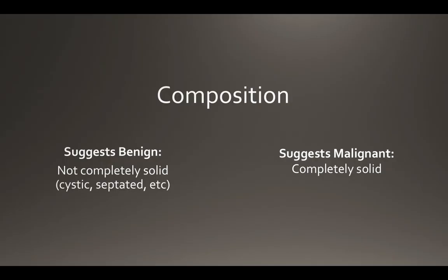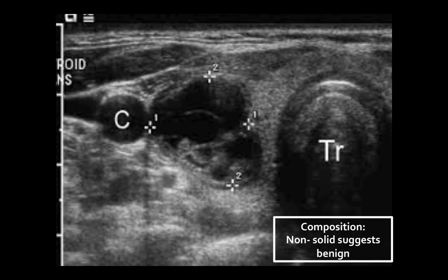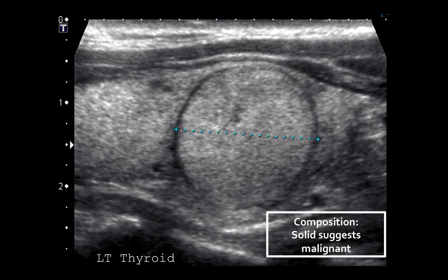Next is composition. What we are really concerned about is whether the nodule is completely solid, often a characteristic of malignant nodules, or if it is not. Here we see a nodule on the right lobe of the thyroid with a cystic appearance with numerous septations — often referred to as a honeycomb pattern — and this suggests a benign lesion. This nodule, however, is very clearly solid. There's a small point of hypoechogenicity in the center which may be the vessels feeding the nodule, and this pattern is concerning for malignancy.